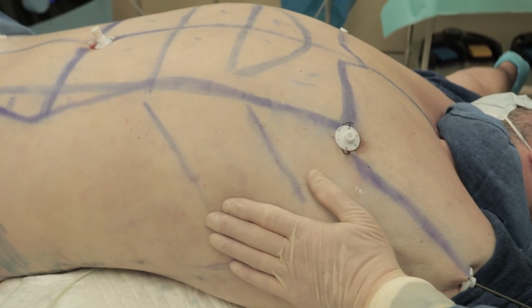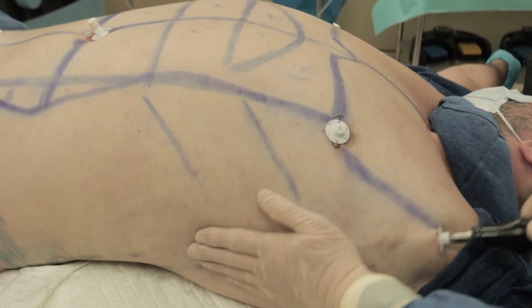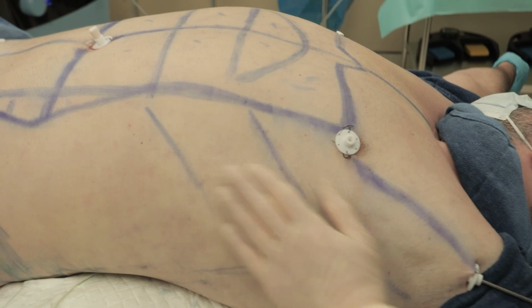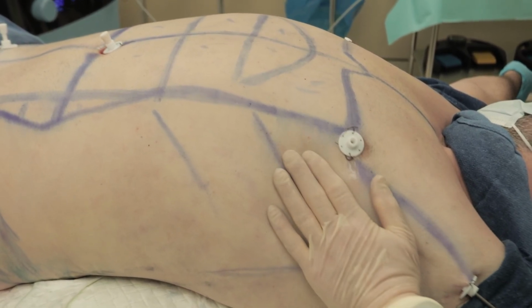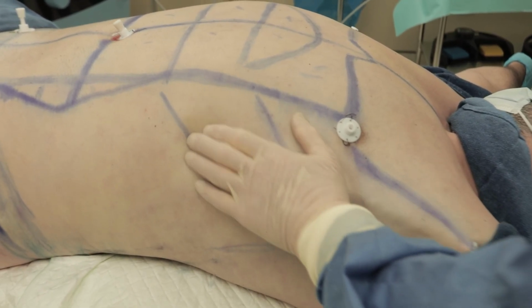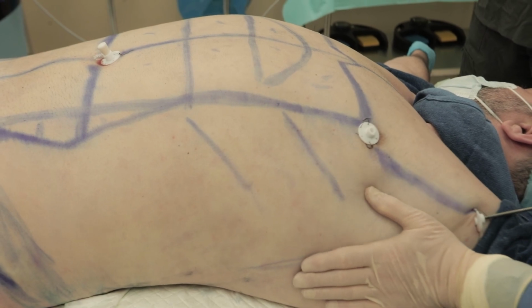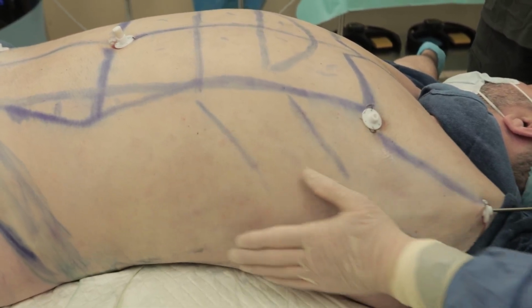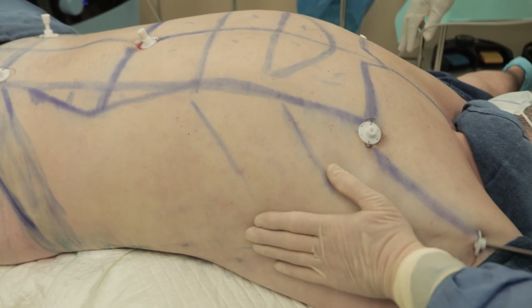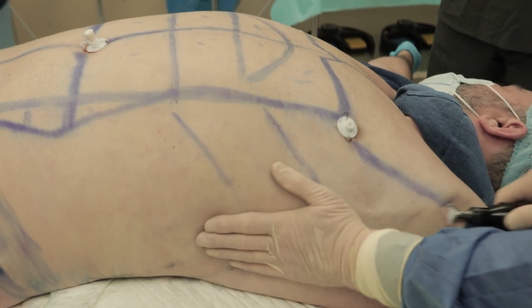And the beauty of this on the local is I get feedback from the patient. So if I'm going a little too deep, I hit his rib, he goes, I can feel it. And I say, oh, careful. That's why local anesthesia with this lipo is a lot safer, in my hands, my belief. Under general anesthesia they generally have no patient feedback, and there's been some harm. With local, his ribs are not numb. And if I go a little too deep, a little too aggressive, he'll say, Doc, and I'll go, oh. 30 seconds. Danger, Will Robinson.